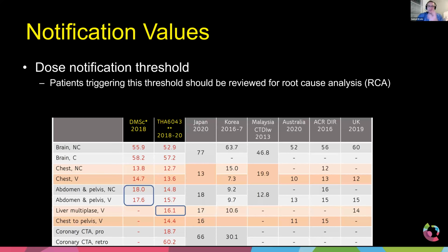Some of these patients, if they have a high heart rate, you may need to open up the padding. So even though you're doing prospective, you're actually acquiring more of the systolic phase, so that you can then look at maybe 3 or 4 percentage, 3 or 4 values on that percentage. And so yes, there is a reason why the dose can be high.